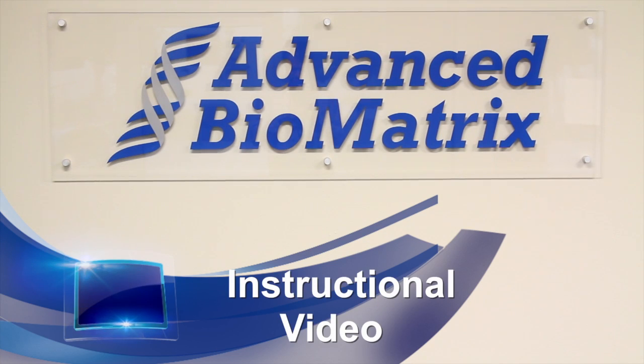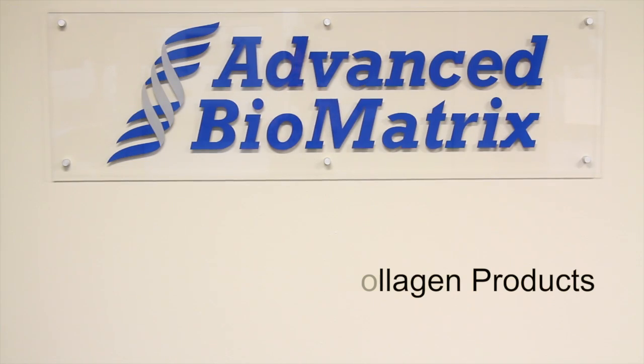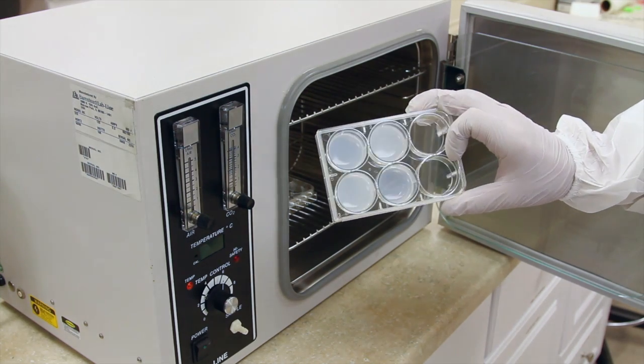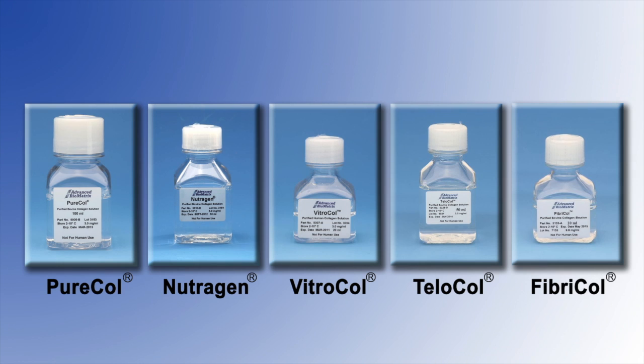Welcome to this product preparation instructional video for making 3D gels from Advanced Biomatrix Collagen Products. In this video, we are using the PureCol Collagen. However, the same methods and procedures can be used for several of our collagen products, including PureCol, Nutragen, VitroCol, TeloCol, and FibriCol.